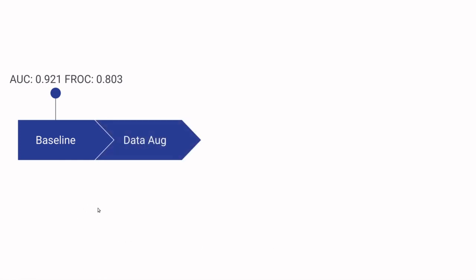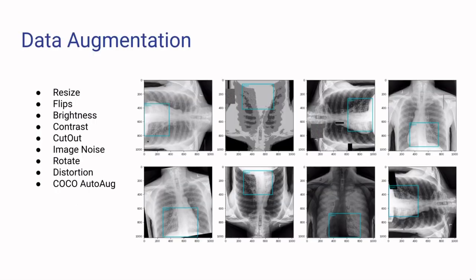While data augmentation is quite a common and powerful technique for generalizing our models, in this challenge I have used a big range of different data augmentations, which have been proven in past research.